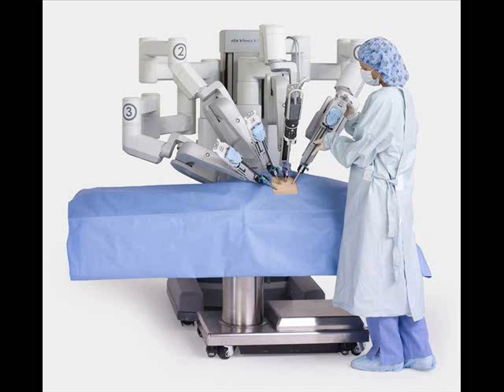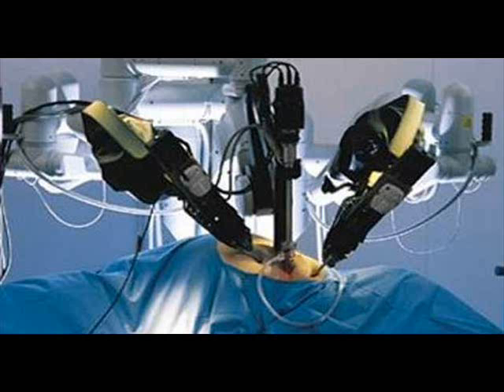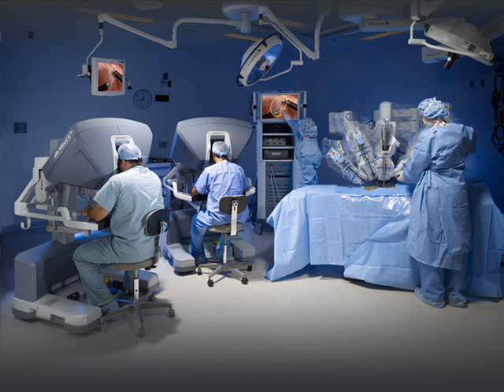In the case of robotically-assisted minimally invasive surgery, instead of directly moving the instruments, the surgeon uses one of two methods to control the instruments, either a direct telemanipulator or through computer control. A telemanipulator is a remote manipulator that allows the surgeon to perform the normal movements associated with the surgery whilst the robotic arms carry out those movements using end effectors and manipulators to perform the actual surgery on the patient. In computer-controlled systems, the surgeon uses a computer to control the robotic arms and its end effectors, though these systems can also still use telemanipulators for their input.